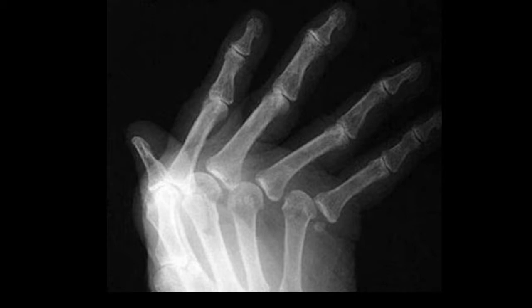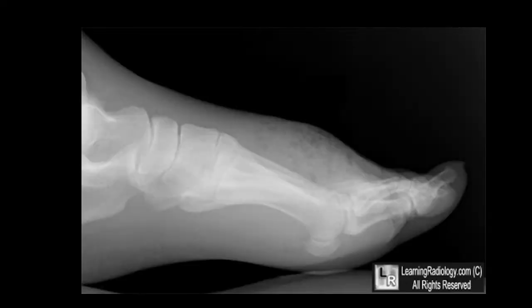If some contact remains but the joint surfaces are not opposed, the joint is then subluxed. Also note if a fracture involves the joint. Are there any features of joint damage or degeneration? With the soft tissues, note any disruption to suggest that there is an open fracture. Look for any localized swelling. That is it for the general approach.